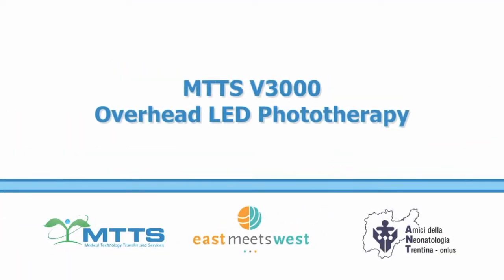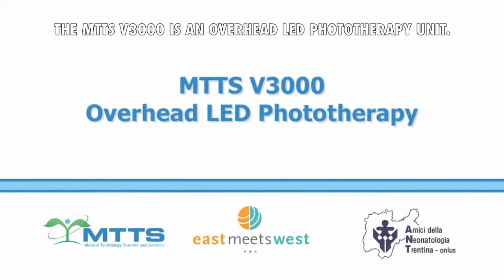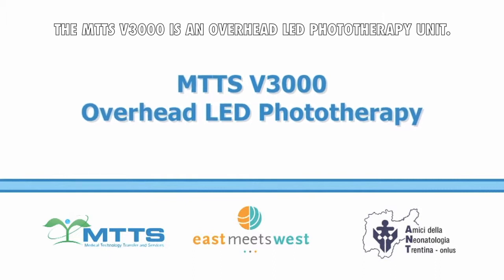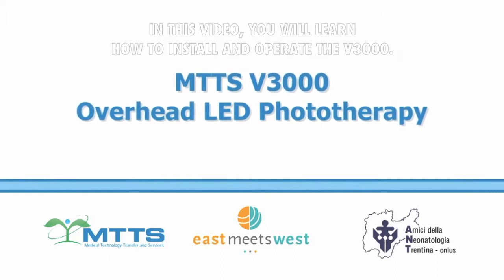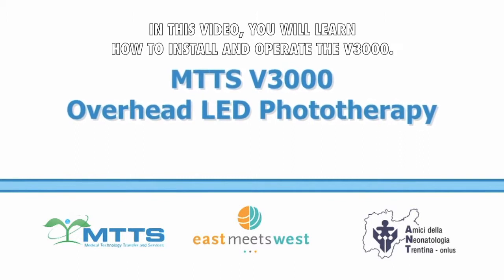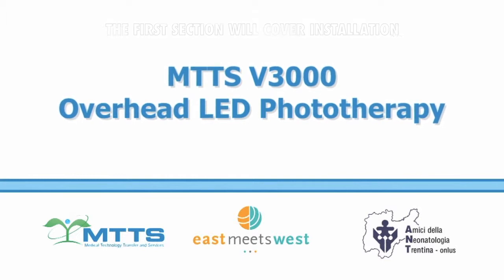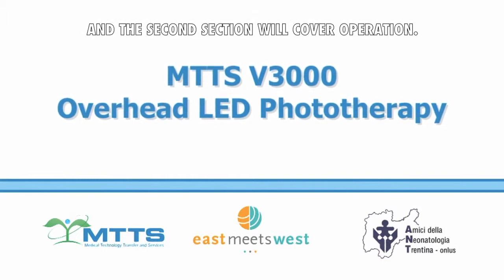The Overhead Phototherapy MTTS V3000 is an overhead LED phototherapy unit. In this video you will learn how to install and operate the V3000. The first section will cover installation and the second section will cover operation.